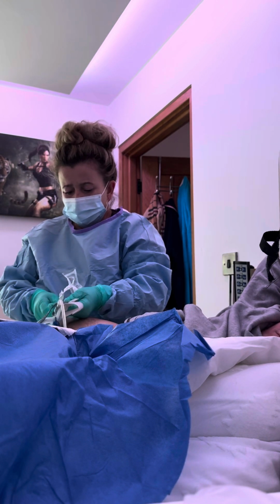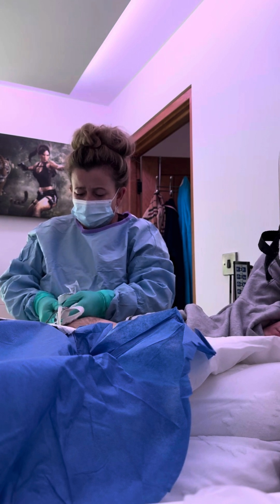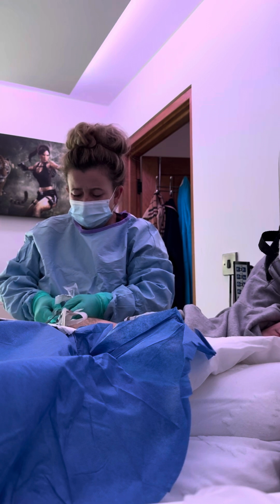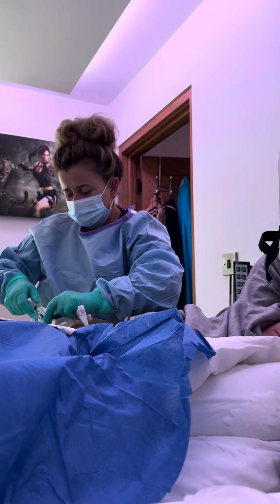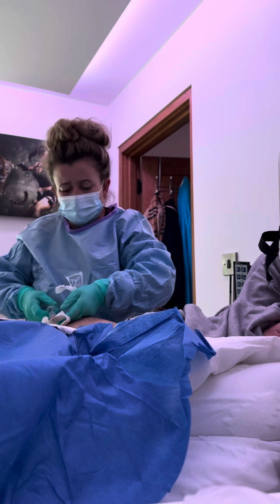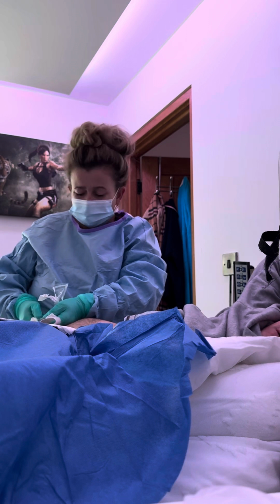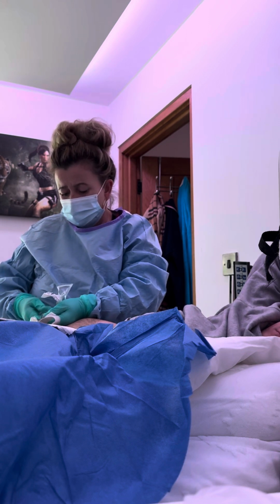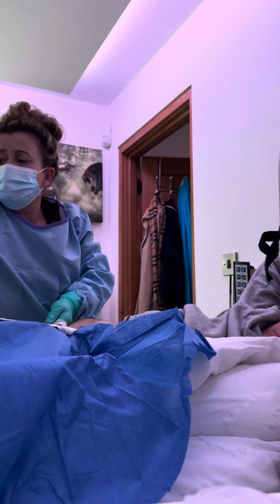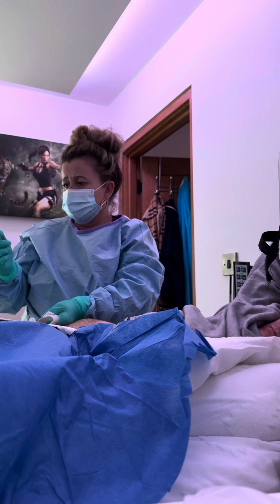So in I go. I'm going to draw back as quickly as I can and see what the hell's going on and how much water we've got in there. How much? You will not believe this. How long has this catheter been in? Two weeks. So again, another catheter that's been in two weeks. I have got him on antibiotics. And how much water's in it? Just about to see now.